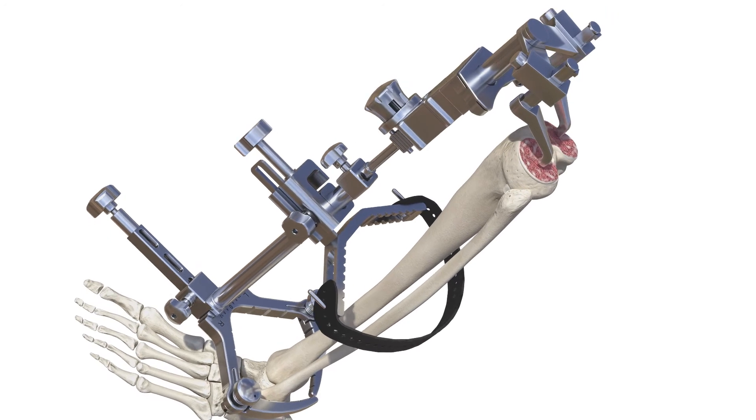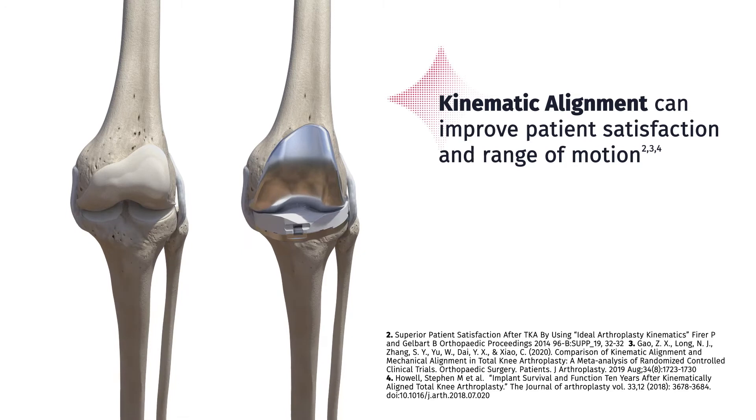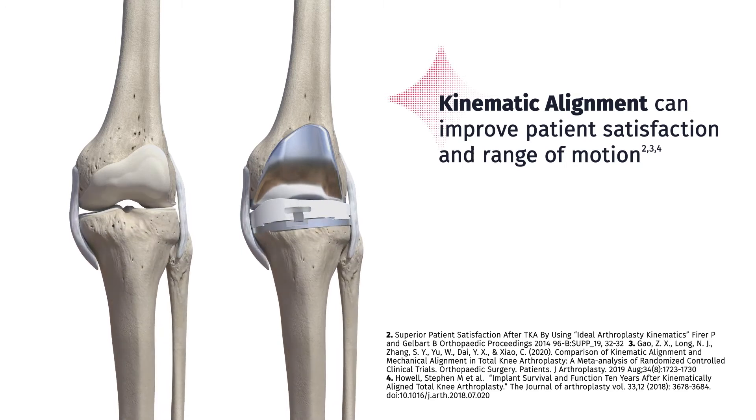By putting the knee in its natural position, the Kinematic Alignment approach has been shown in clinical studies to improve patient satisfaction and range of motion.